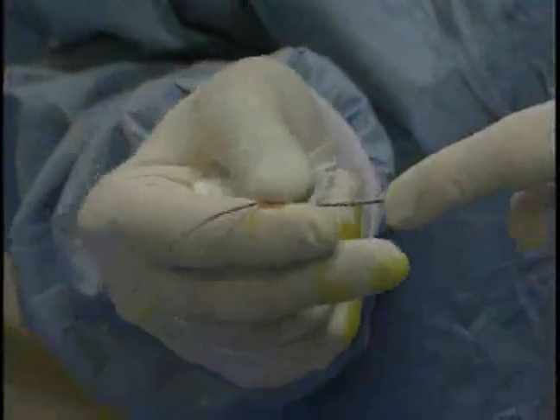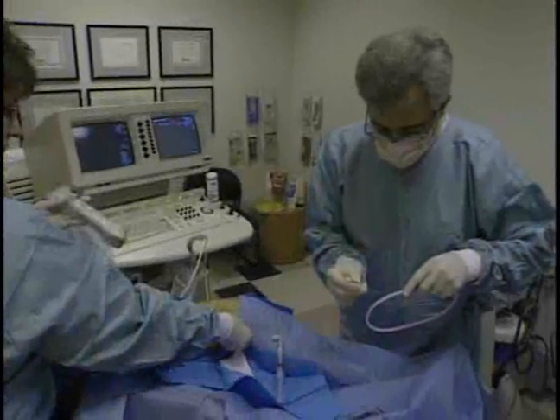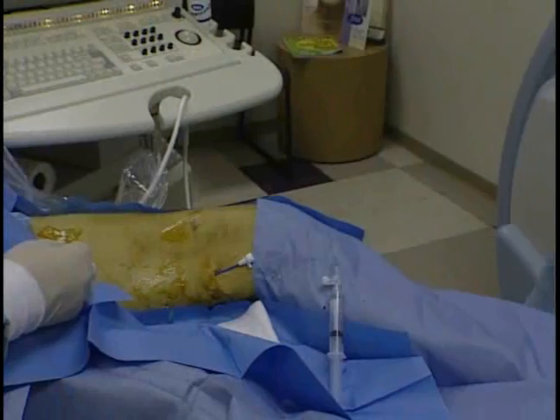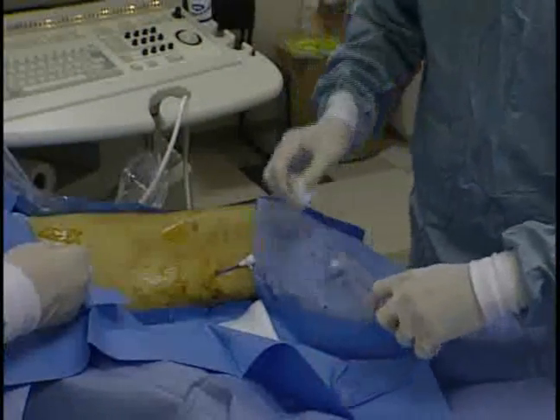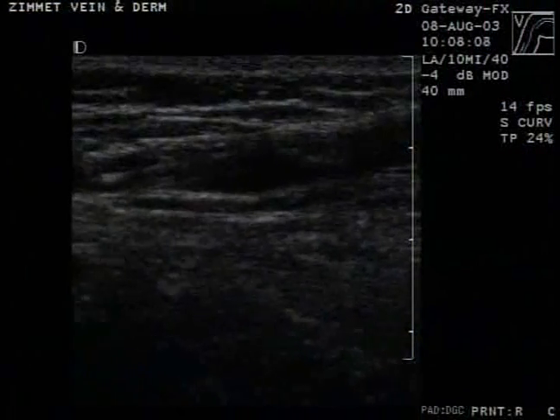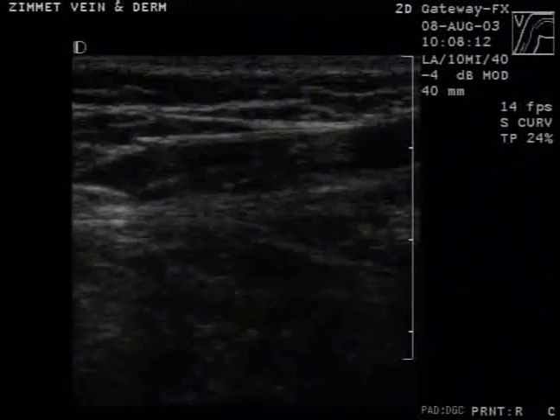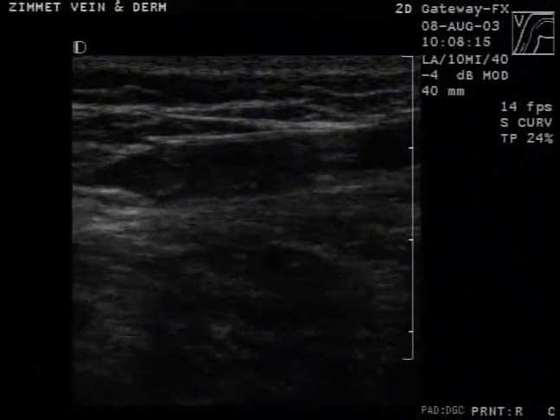A 5 French introducer sheath is placed over the wire into the CFV. Remove the wire and internal dilator once the position of the sheath is verified with ultrasound. Intraluminal position is confirmed by aspiration of non-pulsatile venous blood. Withdraw the sheath under ultrasound control until the tip of the sheath is about 1 centimeter distal to the SFJ.